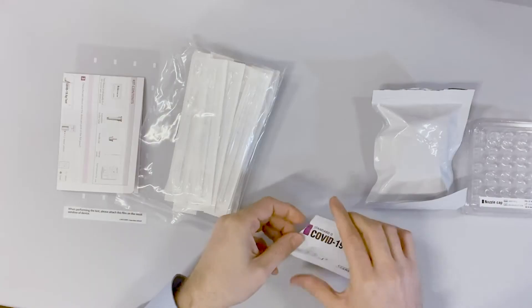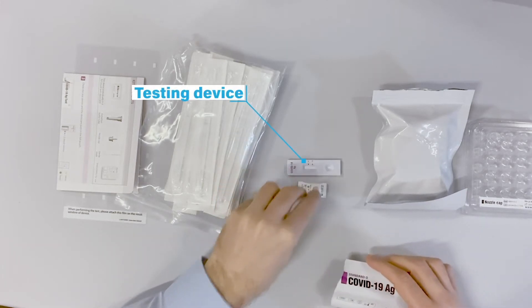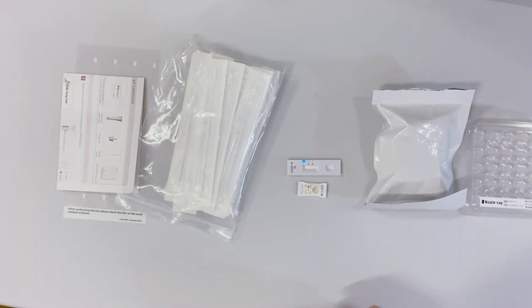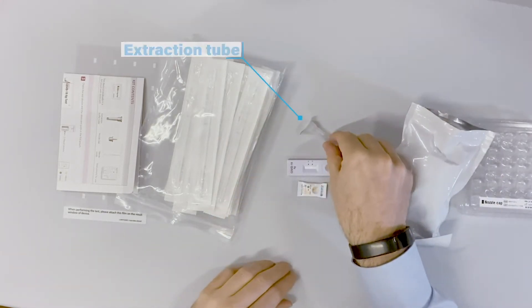Let's see what's inside the diagnostic kit. As you can see, the test device itself is packed in a foil pouch with desiccant to keep it dry. This is the extraction tube and in this kit the buffer is already pre-filled in the tube.